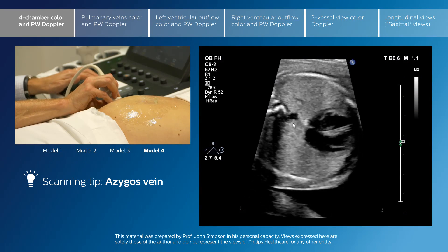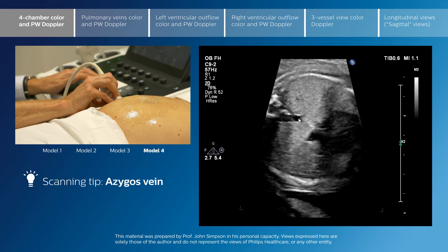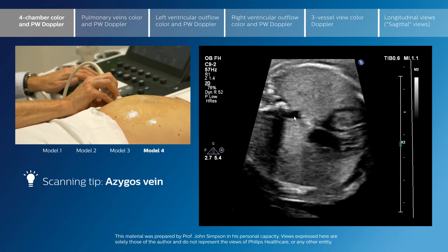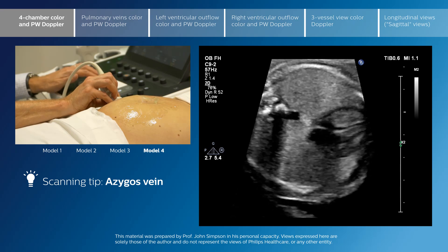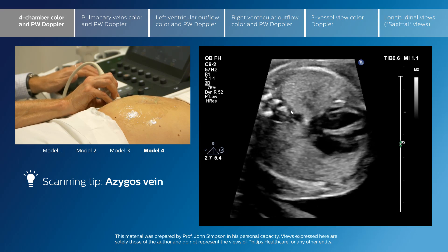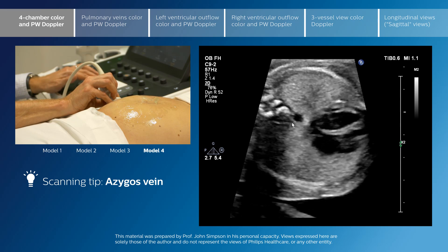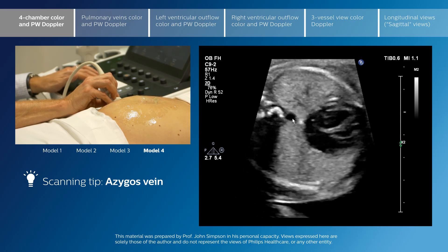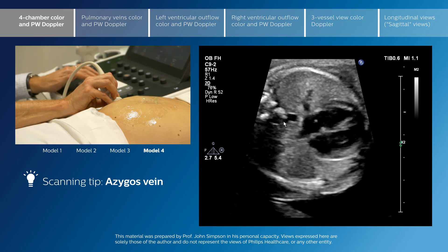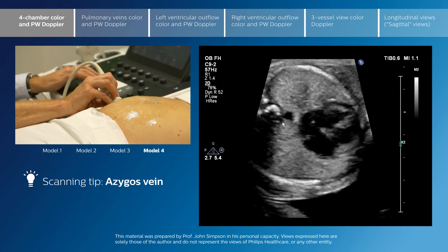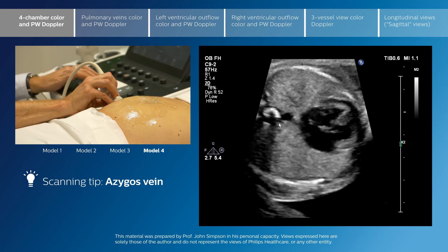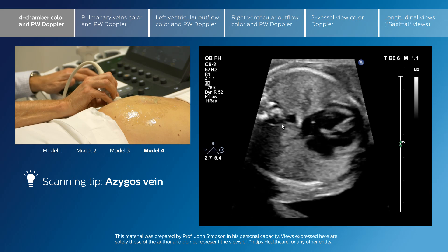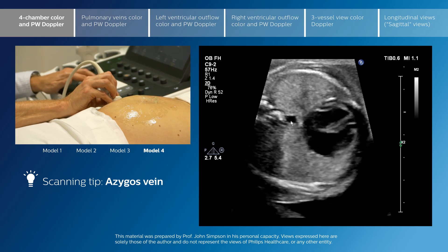Also we see here — which has caused some diagnostic confusion with higher-resolution equipment — that beside the descending aorta you can see a very, very small vessel sitting alongside. This is in fact the normal azygous vein, and this should not give concern. This is a normal finding in the fetal heart, seen more clearly because of the high resolution. Of note, a vein lying in this position should be tiny by comparison with the size of the descending aorta.